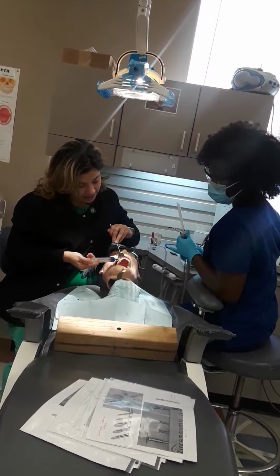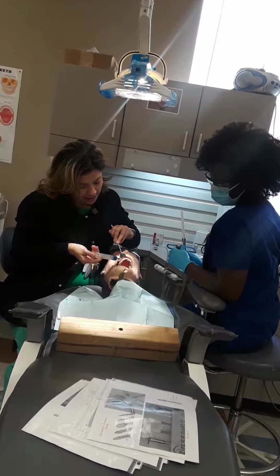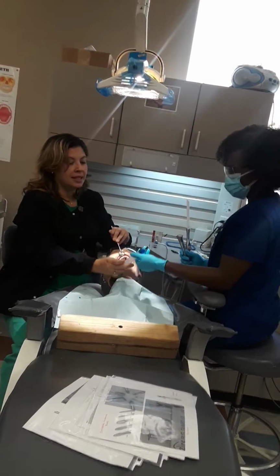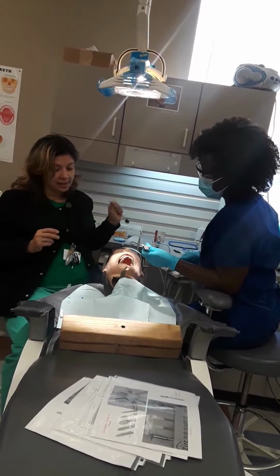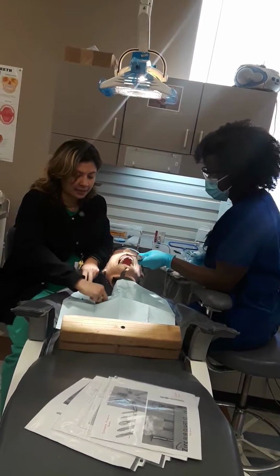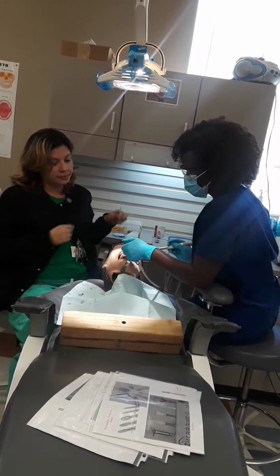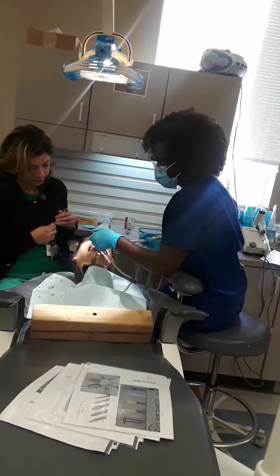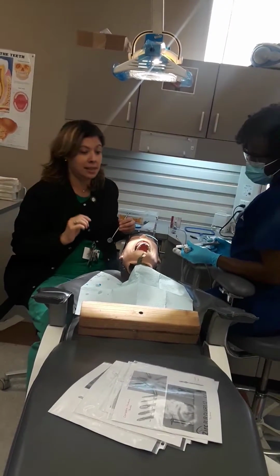This only goes inside the prep on each wall that the prep is. You can't put it on any other surface or tissue, only the prep. And how long? Okay, 4, 5, 6, 7, 8, 9, 10. So it would be 10 instead of the 30. I can't hear you. Oh, it would be 10 seconds instead of the 30. Right, yeah, so cross that out and it's 10 seconds.